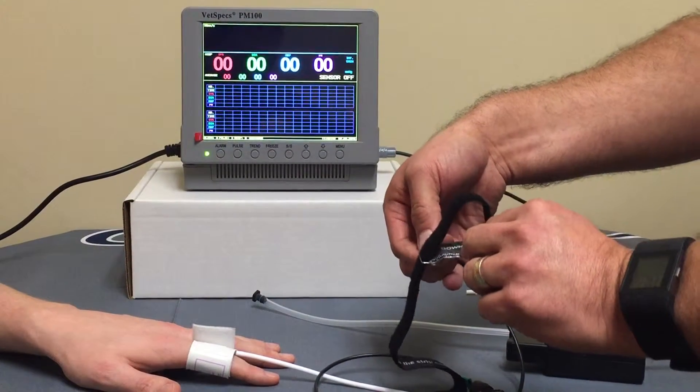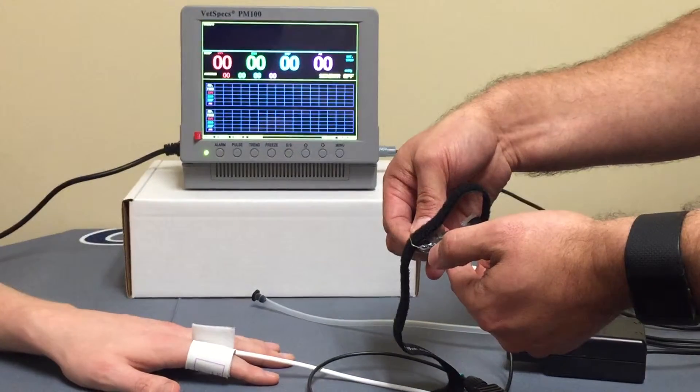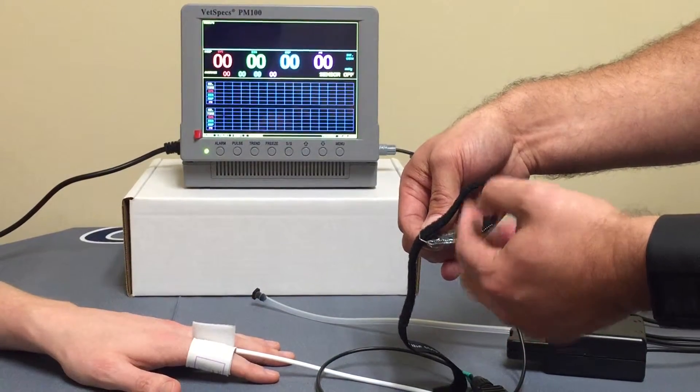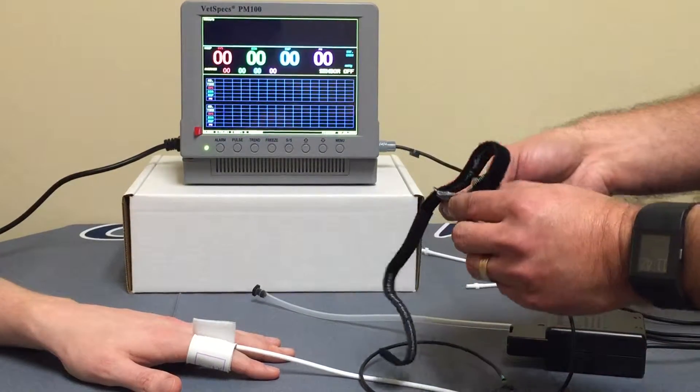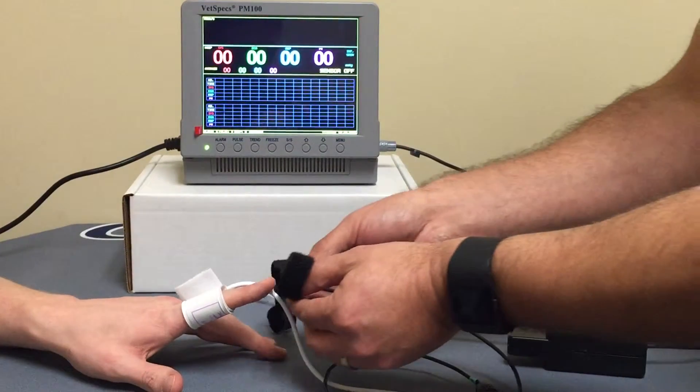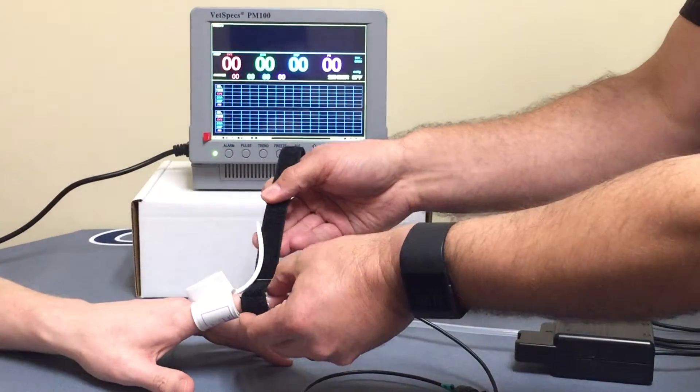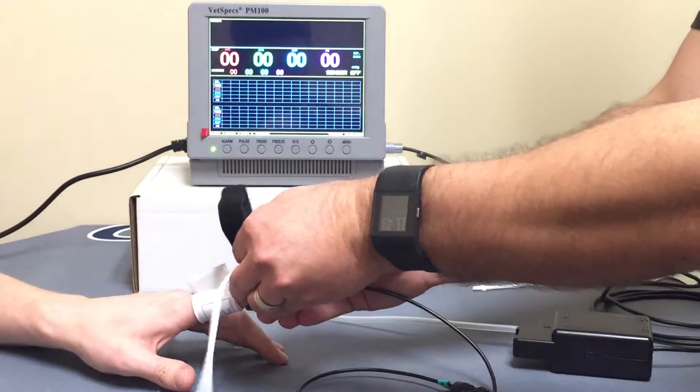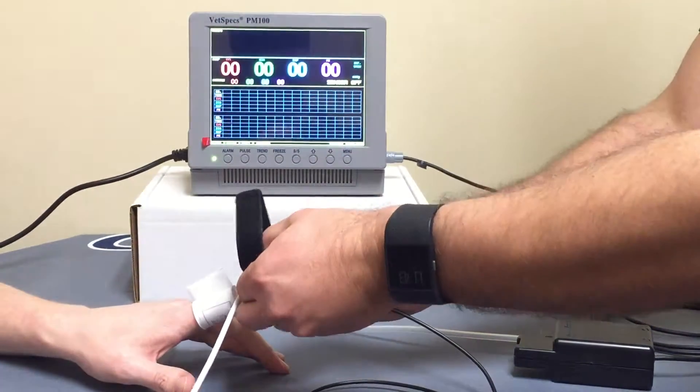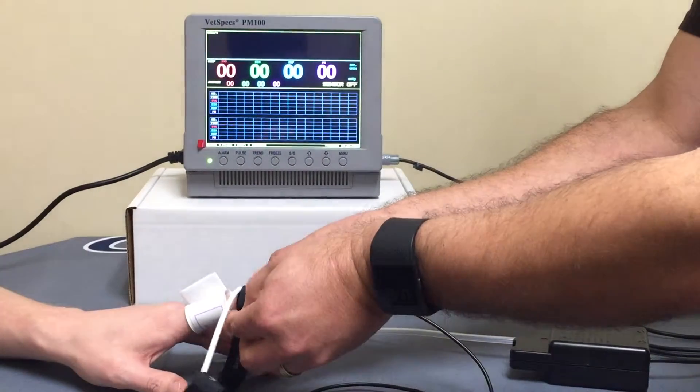VetSpecs has gone to the efforts of putting the word down so that we place the word down against that same artery, and that will help to ensure that we get a good reading or a good signal. So I'm going to go ahead and hook that up again on the same artery, ventral aspect of the finger. When we put the sensor band on, remember this is counter pressure, so we're looking to create counter pressure against the artery. Pull that band on a snugness level of about an eight on a scale of one to ten.